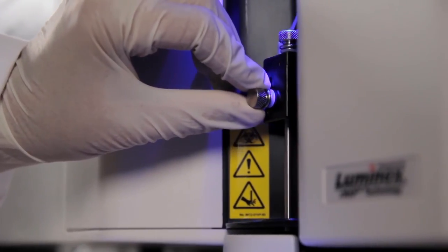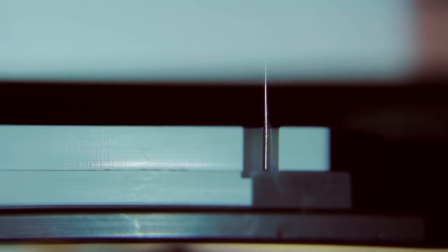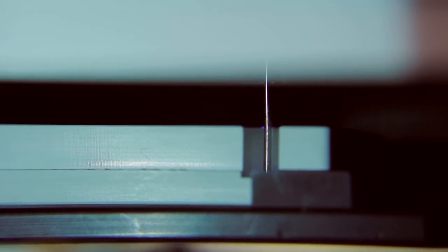Move the needle manually so that it just touches the bottom of the needle adjustment well. Gently move it up and down a couple times to verify that it is barely touching the bottom of the well.